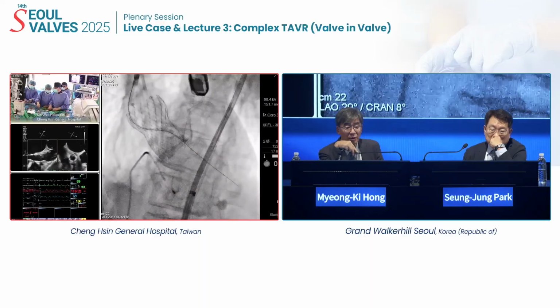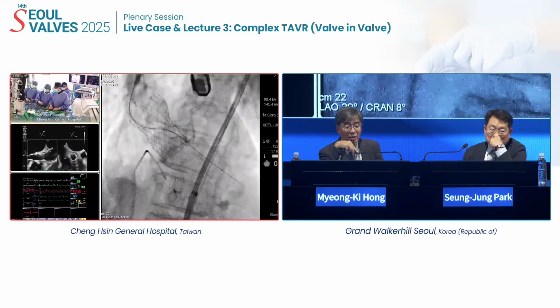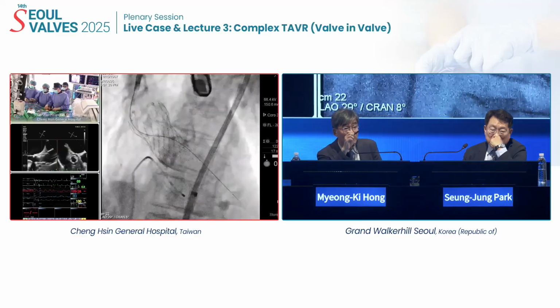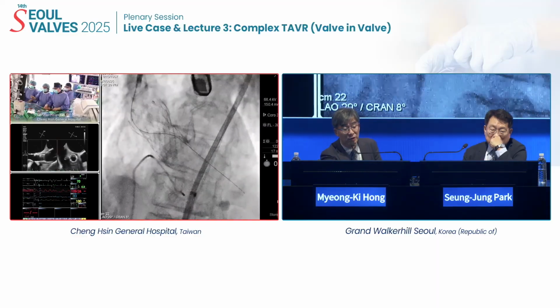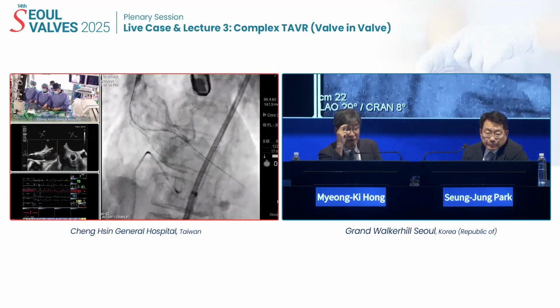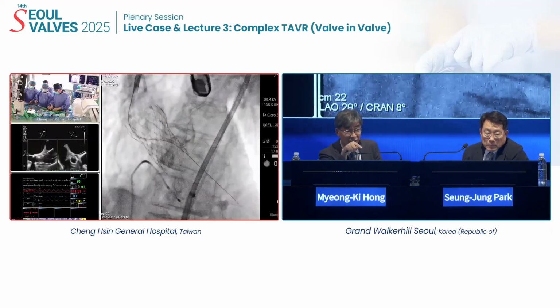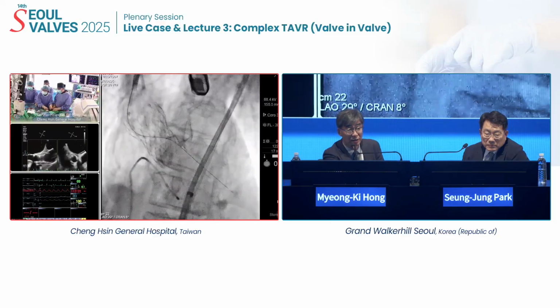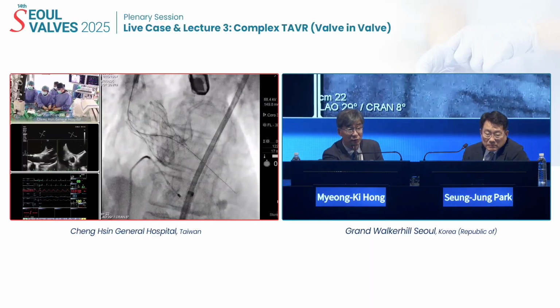We have made inflation. Can you hear me? Dr. Kim, please use the mic. You mean in the short axis view, in the transesophageal, and then we can confirm the correct cannulation. You mean at 1 o'clock in the short axis view? Oh, okay.